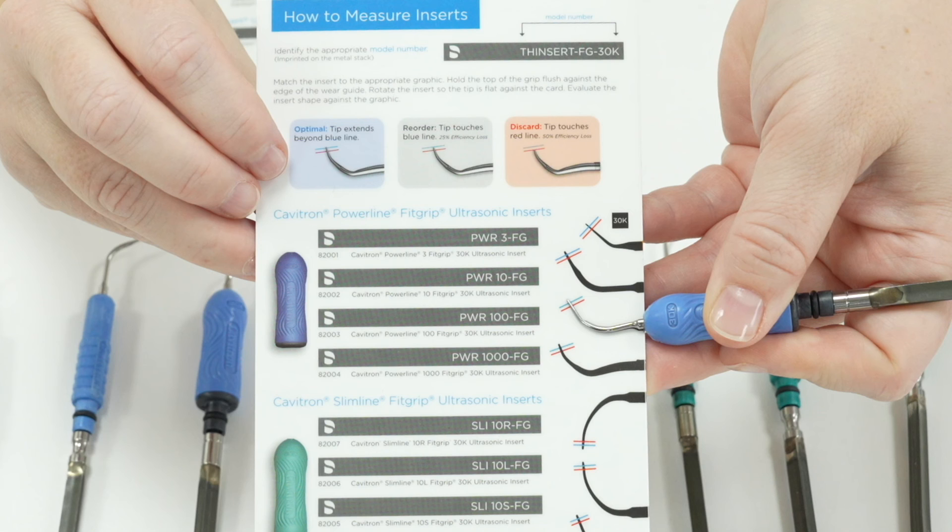The insert will wear down very quickly after it goes beyond the blue line, probably within a few months. Once it goes beyond the red line the insert needs to be discarded because no efficiency and no power is coming through that tip. The shorter an insert gets the less and less it can do — it would be more efficient at that point to use a hand instrument.